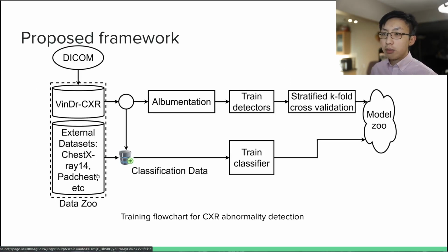So after combining all we have discussed, we arrive at the following, which is our testing scheme. Given a chest radiograph, we first utilize our two-class classifier, whether the ResNet 50 or the EfficientNet, and classify it. If an image has no abnormal finding, then our modeling ends here. It has no abnormal finding after all.